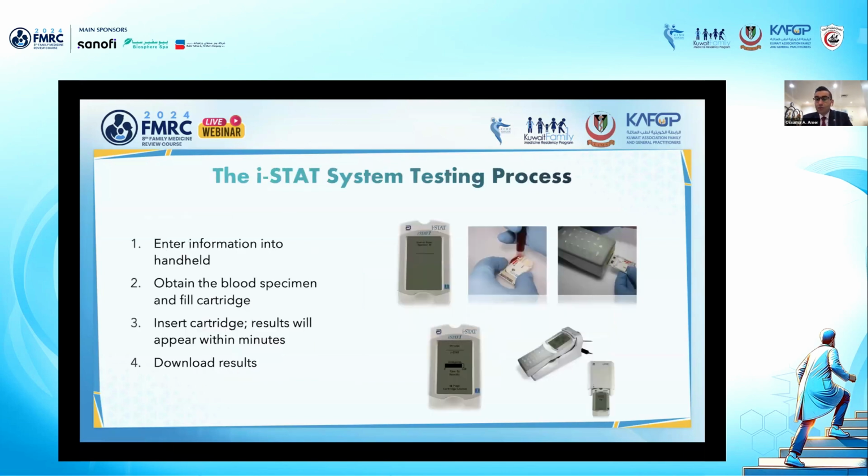Now I will talk about the process of using the iSTAT. As I said before, it's easy to use. You only need 4 steps to get the results. First, enter the information of the patient in the handheld by scanning the patient's barcode if it's available in your center, or you can enter it manually.